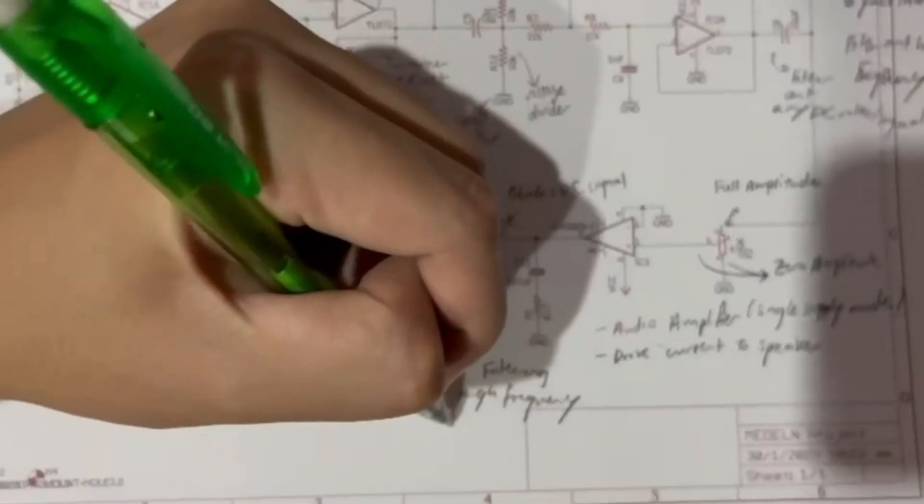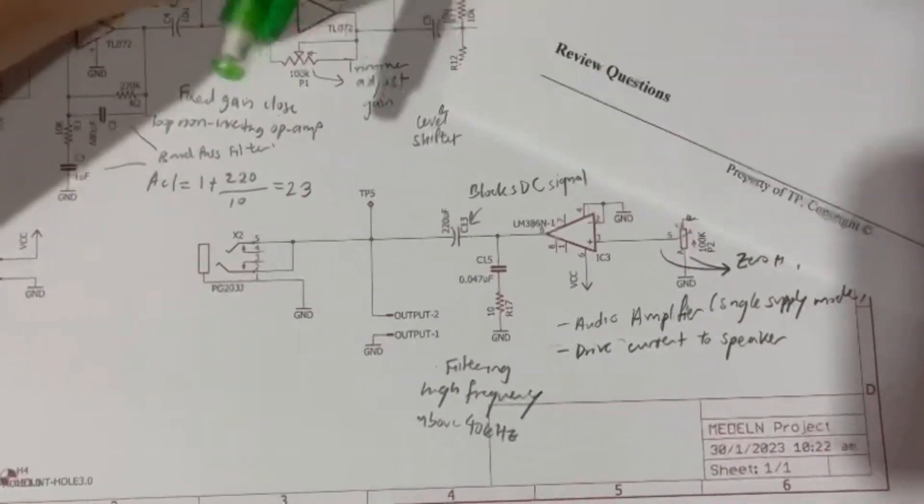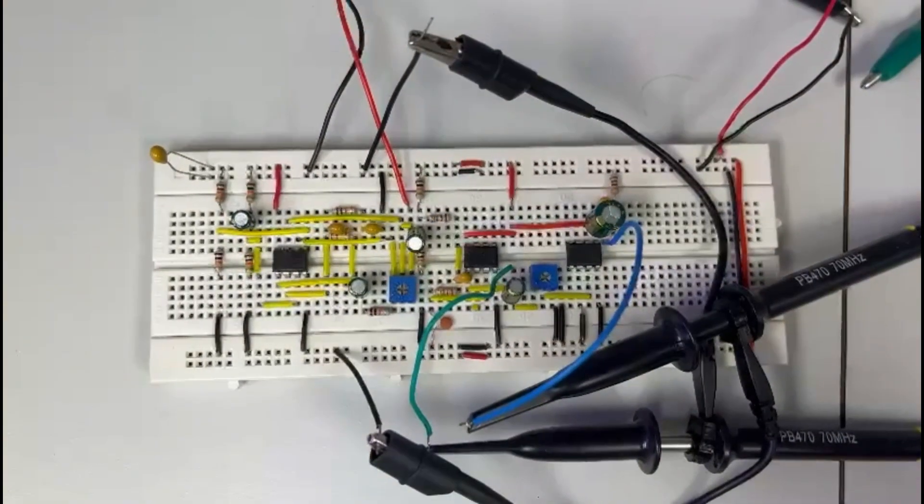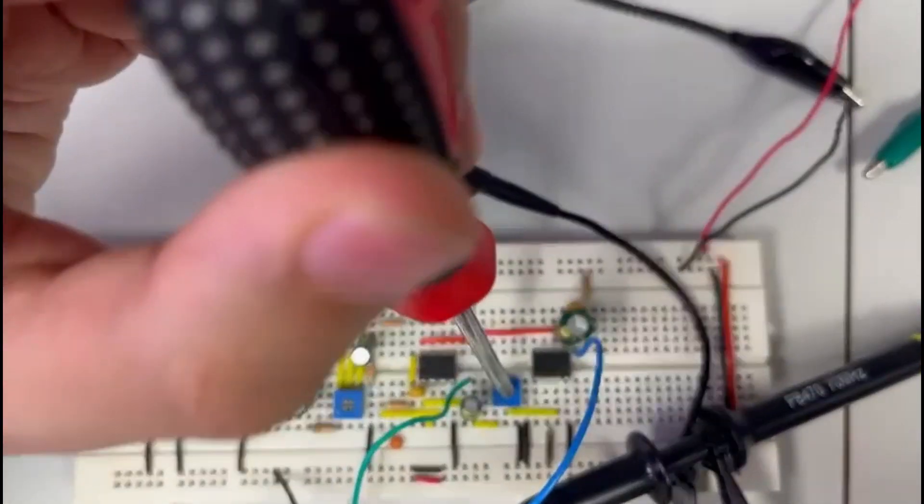Connect channel 1 to TP4 and channel 2 to test point 5. By adjusting the trimmer, we can adjust the output at test point 5. The final output will be the final sine wave attained without being saturated.